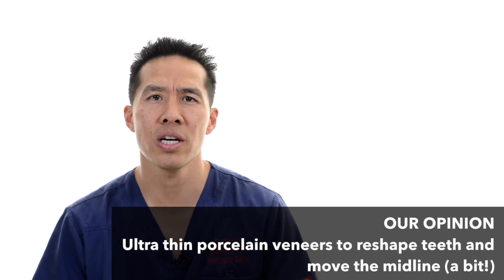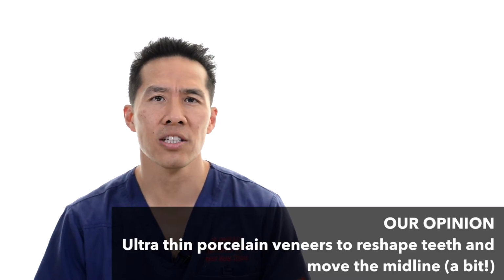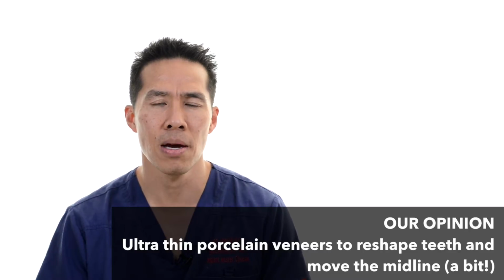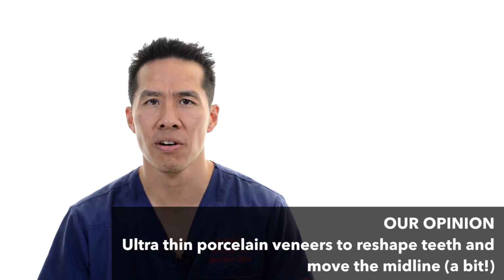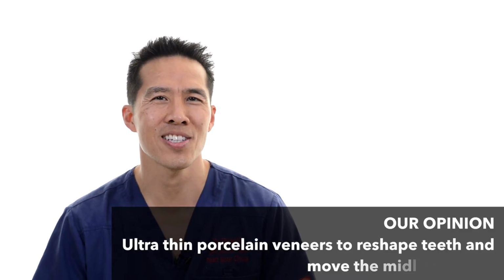So when he first came to see me, we really wanted to look at whether we could do porcelain veneers on him to give the illusion that he had his 2 front teeth, but also just to move the midline a small amount. So I'm going to talk you through the case. It's a wonderful case because it's the son of a very, very old primary school friend, and he's come to see me, so I really want to make sure that this case is absolutely perfect. So I'm going to talk you through the case and I'll catch up with you at the end.